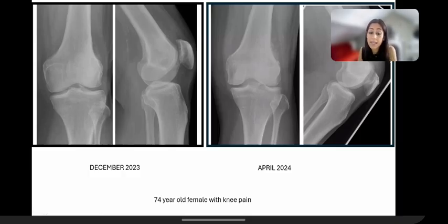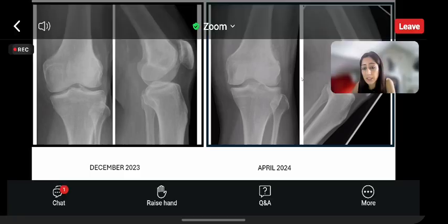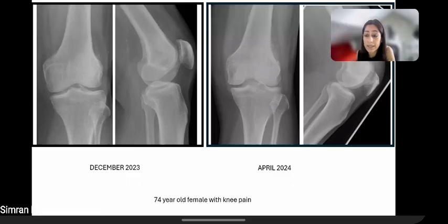The patient came back after 4 months with an excruciatingly painful knee and swollen leg. Of course, now you see the trabecular pattern is definitely altered. There is ill-defined sclerosis with a very wide zone of transition in the distal femur. Periosteal reaction is much more apparent. There is osteoid or mineralization in the extraosseous soft tissue, which is best seen on the lateral projection as well. We biopsied this, and this was an undifferentiated bone sarcoma.